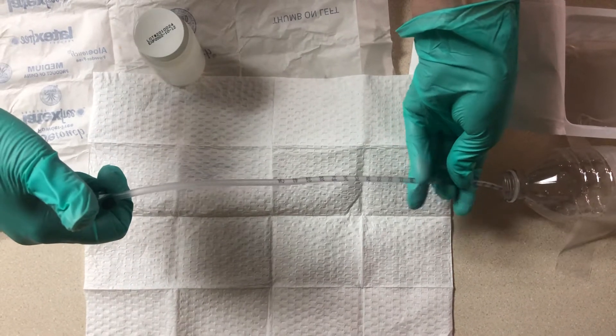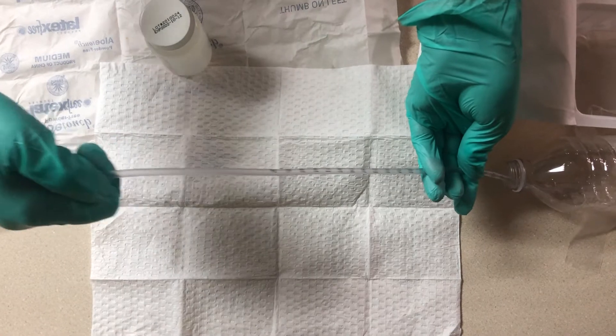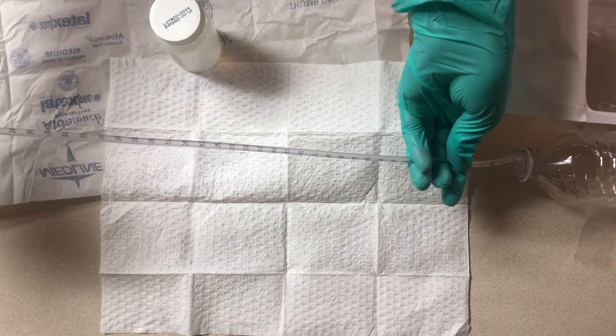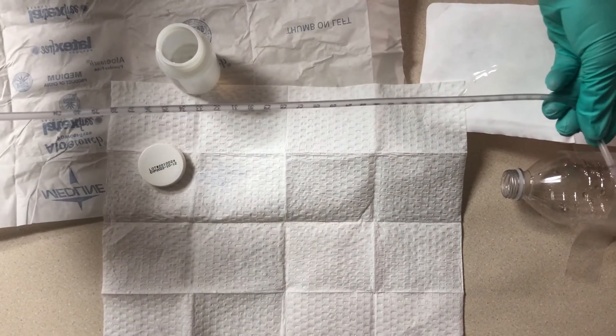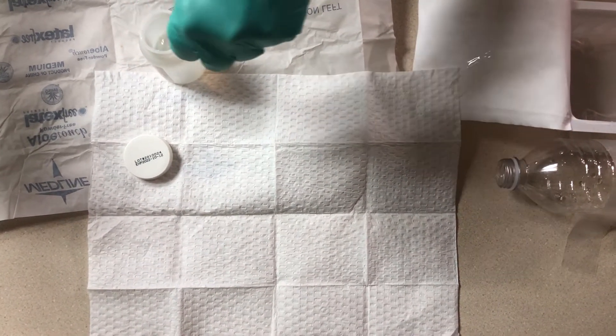Make sure to keep your right hand or left hand thumb hyperextended until you meet resistance or the patient begins to cough. Apply suction. If it's goopy, you're going to want to reach down and take the lid off your sterile water and clean it.